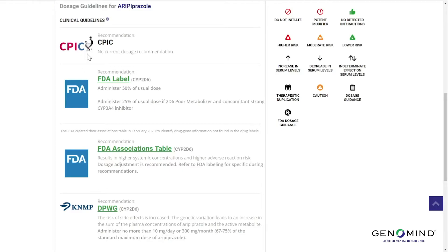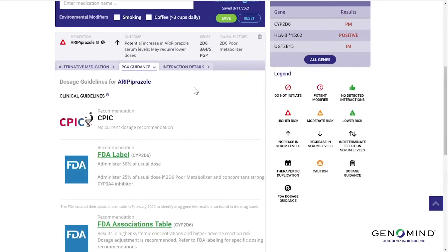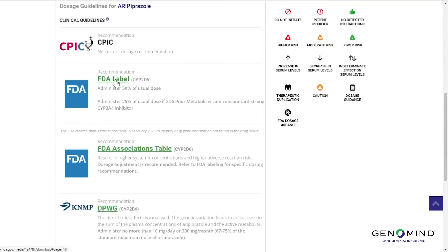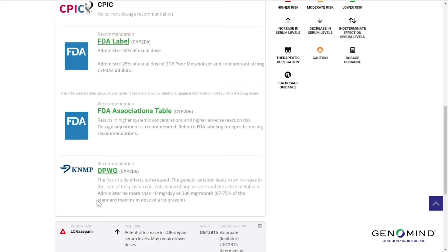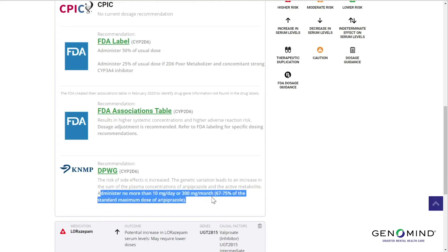CPIC is a global consortium of pharmacogenetic researchers that standardizes pharmacogenetics and publishes peer-reviewed guidelines. DPWG can be thought of as the European equivalent to CPIC. In our aripiprazole example, you can see that the FDA label recommends a 50% dose reduction in this individual who is a CYP2D6 poor metabolizer. The green link will bring you to the actual source of this guidance. DPWG has a guideline as well. Sometimes recommendations may be different between the different sources, so use your best clinical judgment in those instances.